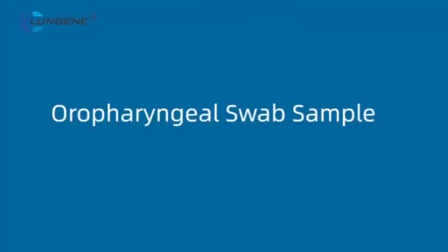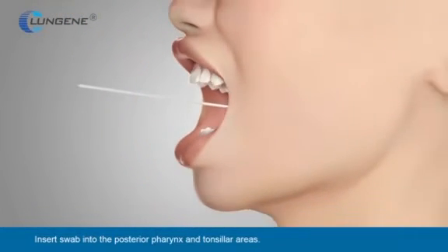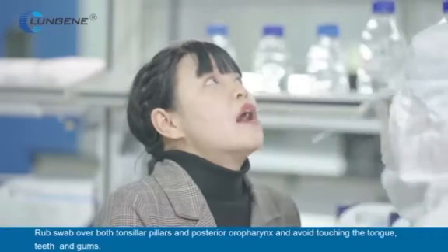Slowly remove swab while rotating it. Oropharyngeal swab sample. Insert swab into the posterior pharynx and tonsillar areas. Rub swab over both tonsillar pillars and posterior oropharynx and avoid touching the tongue, teeth, and gums.